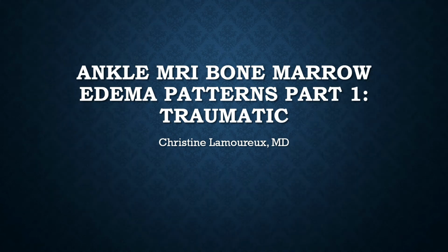Hello, today we're going to be talking about ankle MRI bone marrow edema patterns, and this is part one. First, we're going to be talking about the traumatic causes, and in a second sister module, we'll be talking about non-traumatic causes of bone marrow edema.